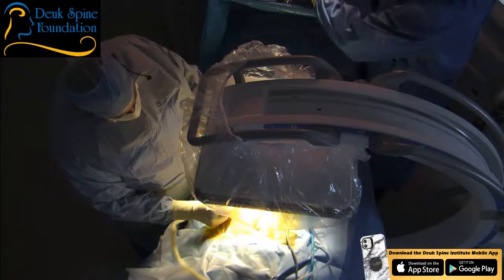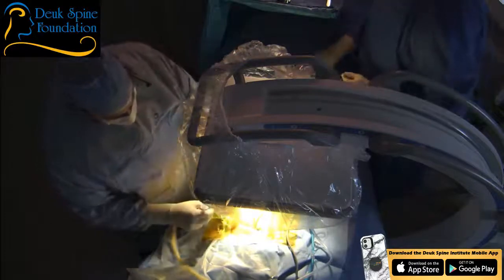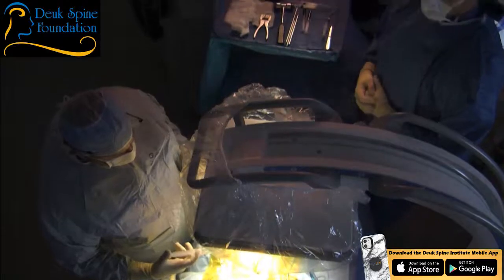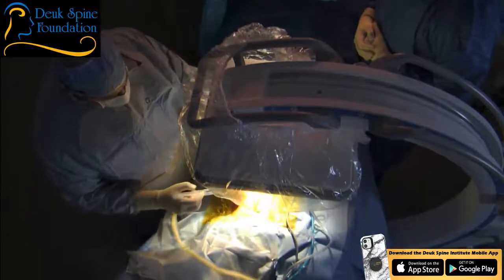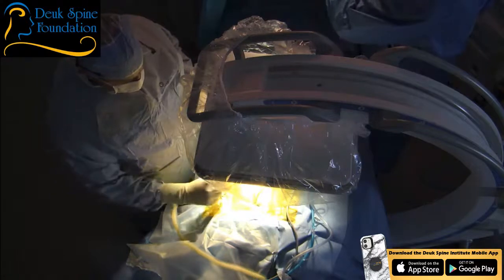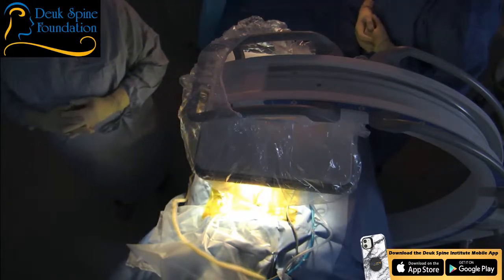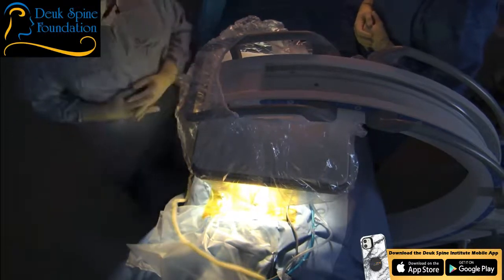We're going to go ahead and get started. So we're treating L5-S1 and L4-5. We're on the right side. Everybody agrees we're on the correct side for this patient? Shot? Oh, really? All right, now when I say shot, we're talking about an X-ray shot. Go to a lateral, please.